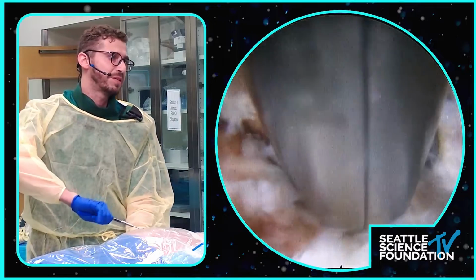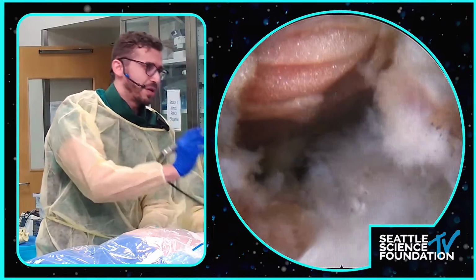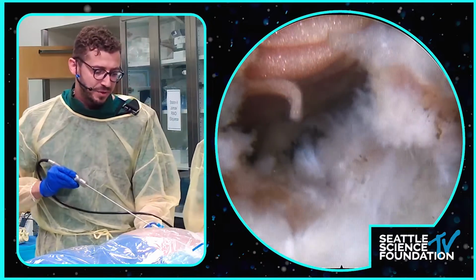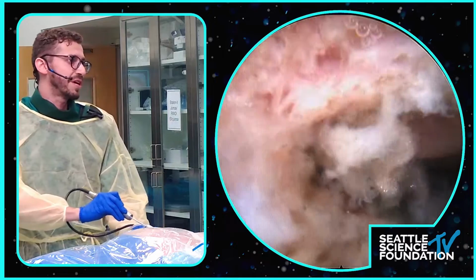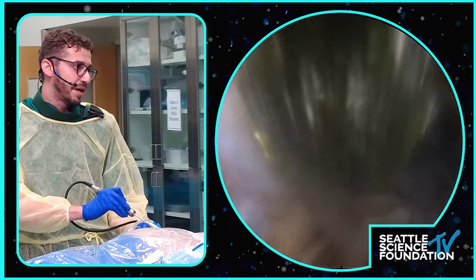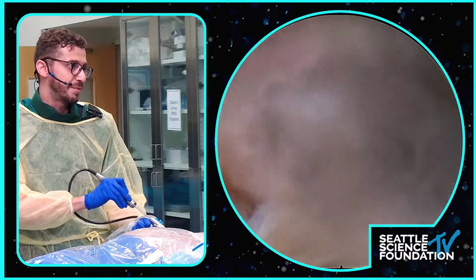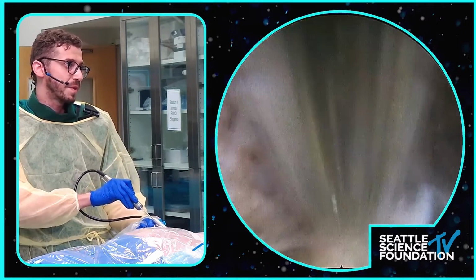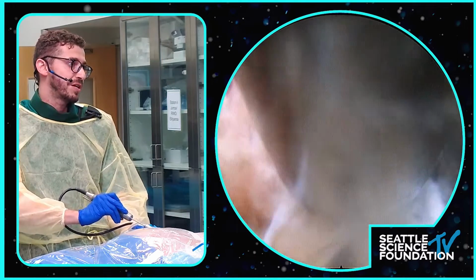So can I have the drill, please? The drill is called a shrill. It drills bone and it drills soft tissue. This over here is the SAP, that's the pedicle here, and as you go down and ventral to it, that's where the osteophyte of the vertebral body is. You know that the drill is working if you see the pebbles on the screen.